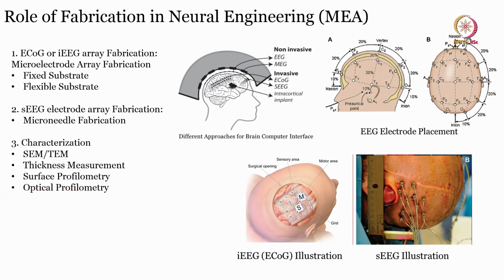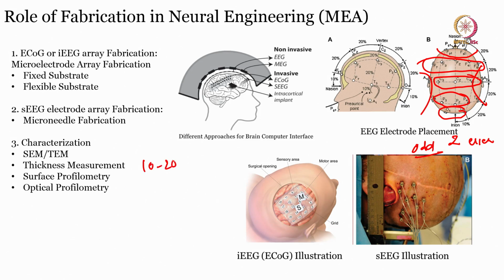So again, this is midline, left sided electrode, right sided electrode. Prefrontal, this is your frontal lobe, this is central, parietal, occipital, temporal. It is a little bit cleaner than the previous one. And again Z, even number, odd number. Very easy. The first question was compared to, this is 10-20, this is 10-10.